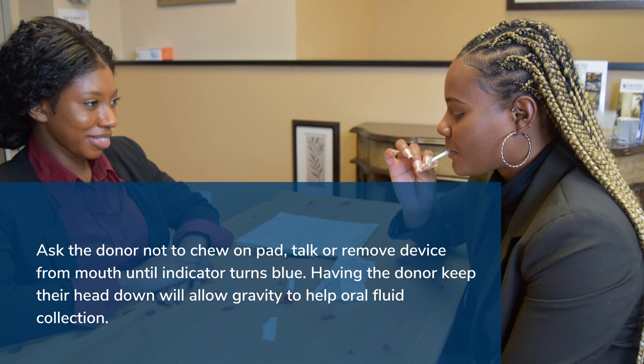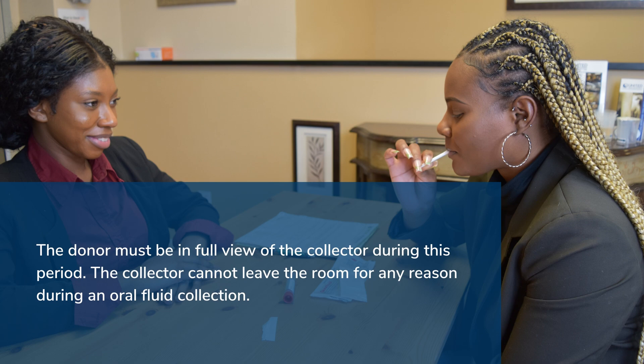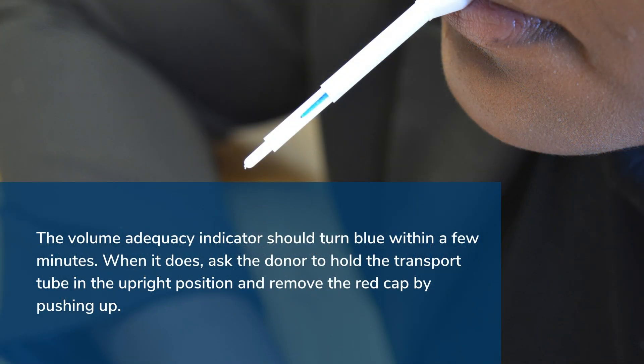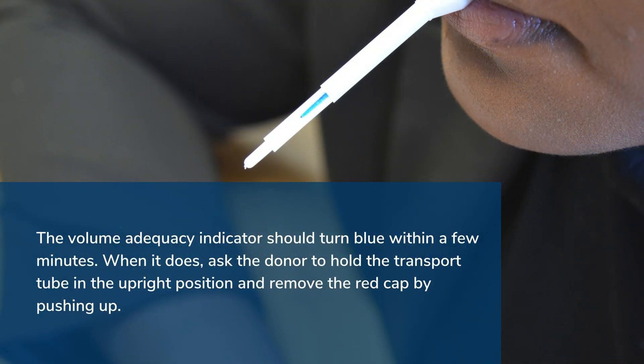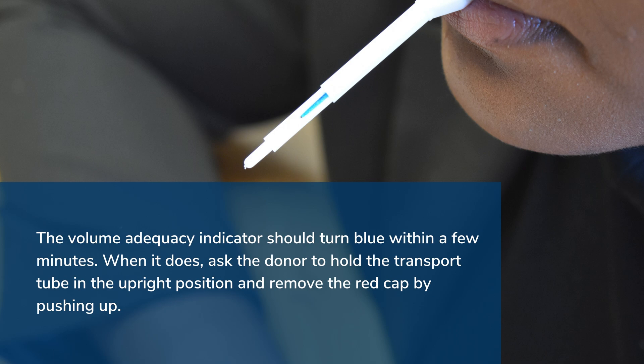Having the donor keep their head down will allow gravity to help with oral fluid collection. The donor must be in full view of the collector during this period, and the collector cannot leave the room for any reason during an oral fluid collection. The volume adequacy indicator should turn blue within a few minutes. When it does, ask the donor to hold the transport tube in the upright position and remove the red cap by pushing up.